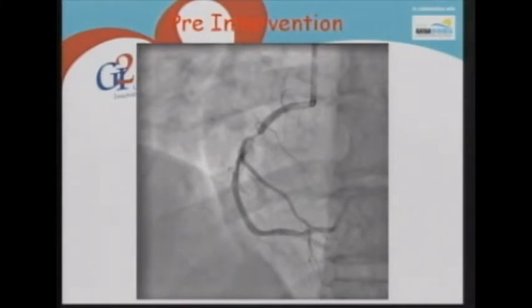It's really open with a single balloon, which is clearly undersized for the main vessel. And then there have been some beautiful cases. I think I'll show that tomorrow with OCT online, 3D OCT online. So you select your cell, not the proximal, not the distal, but the central, to be sure that you do a good dilatation. And I think that's one of the tools of the future. The computation of the 3D OCT is so fast now that you get the image with your wire in one of the 3 cells, and then you reposition. We still have to find a way to reposition systematically, but at least we can see it.